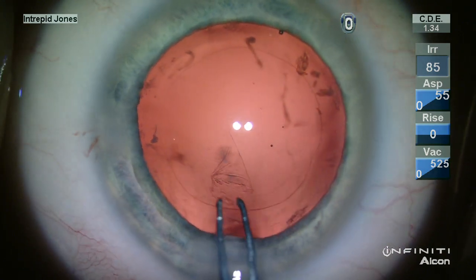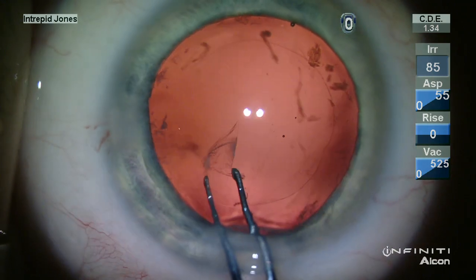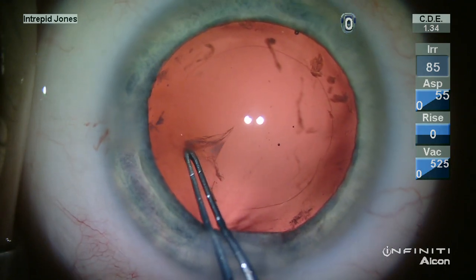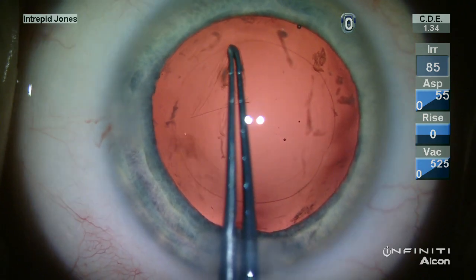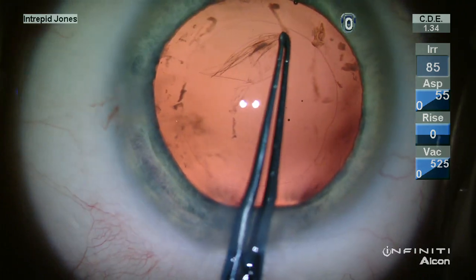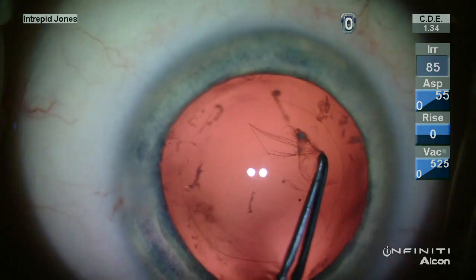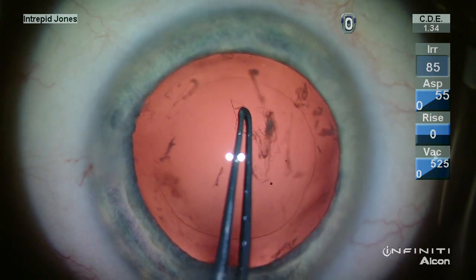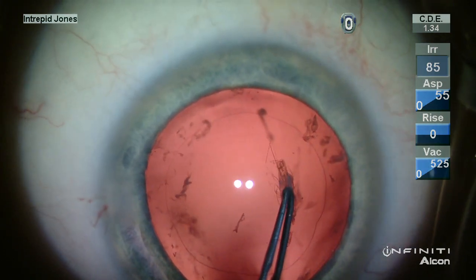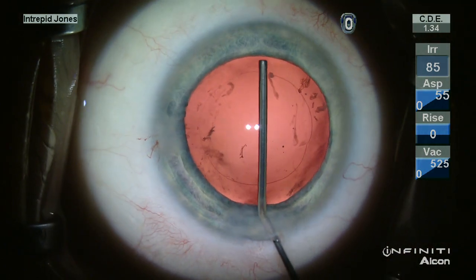You can visualize here the material that's being liberated along with the posterior capsule. I have in the past used extensive efforts of polishing this material, and to my frustration there will often remain some material on the posterior capsule, or potentially a rupture of the posterior capsule with extensive polishing can occur. So for specific patients I have gone to the posterior continuous curvilinear capsulorrhexis.